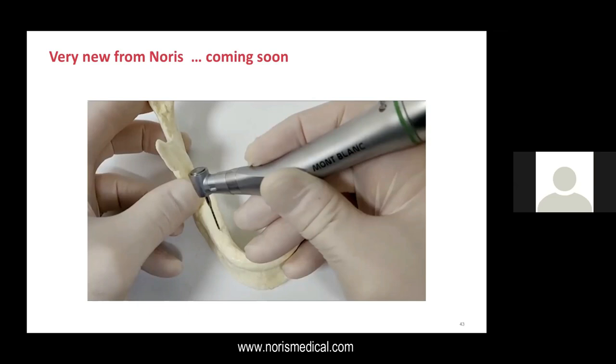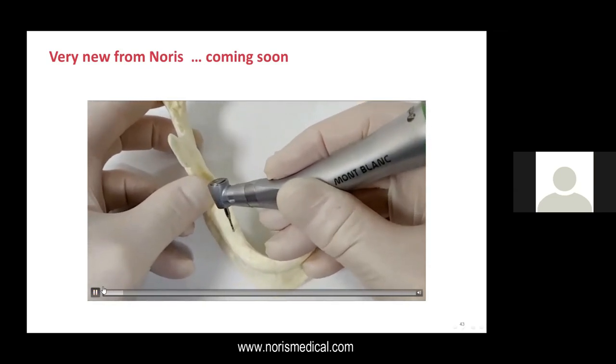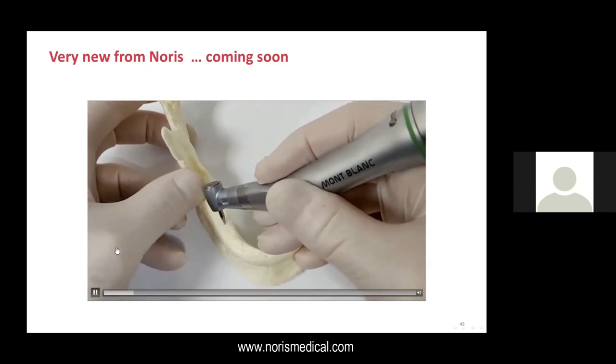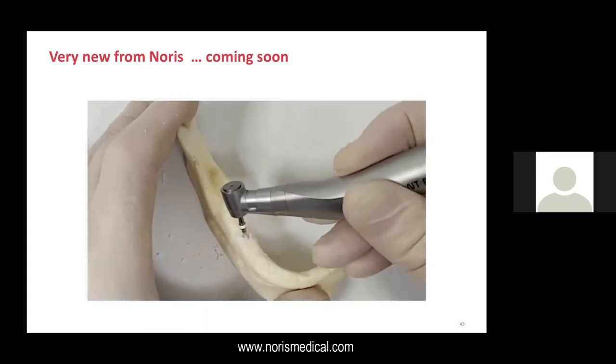Because think that in the regular mono implants, if you broke the neck of the implant, that's it. It will be a little bit difficult to take out the implant. And the key will also have two points of grasping. It grasps itself in the tip of the abutment and in the neck. And the most important thing is that it doesn't make any pressure on the bone. So here you can see a plastic model.